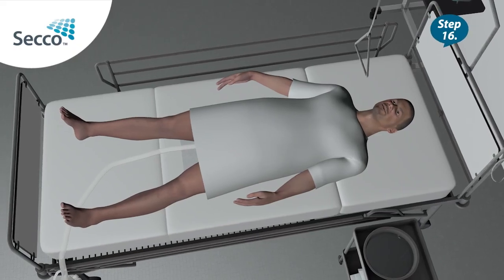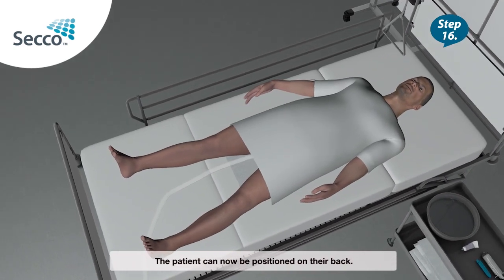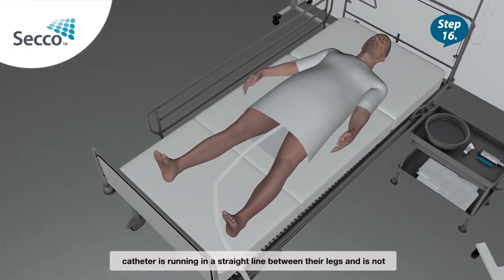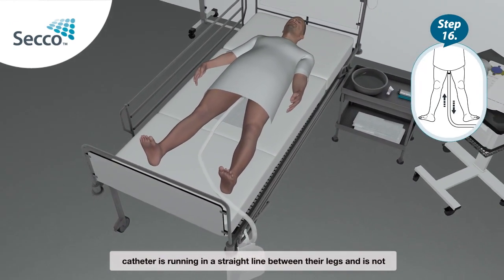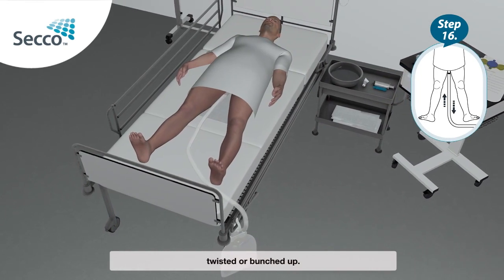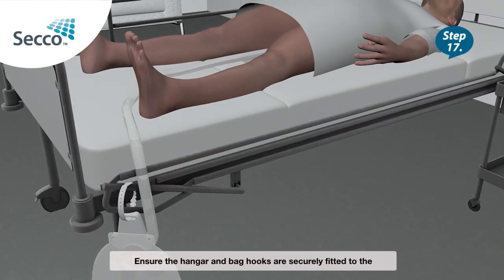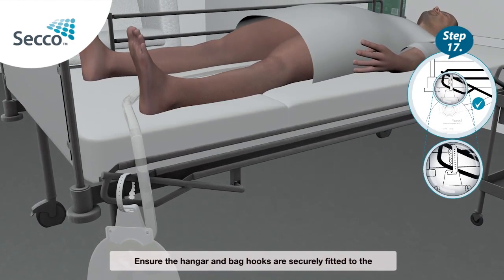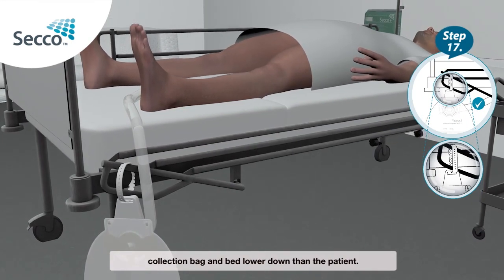Step 16: The patient can now be positioned on their back. Make sure the catheter is running in a straight line between their legs and is not twisted or bunched up. Step 17: Ensure the hanger and bag hooks are securely fitted to the collection bag and bed, lower down than the patient.